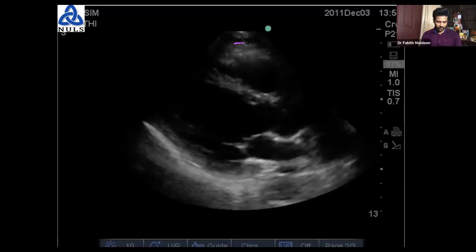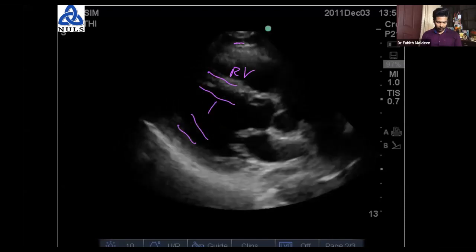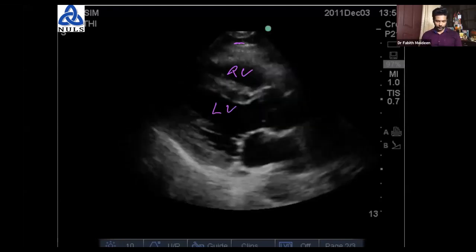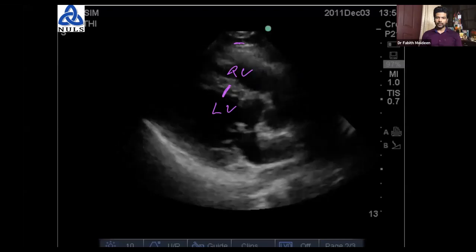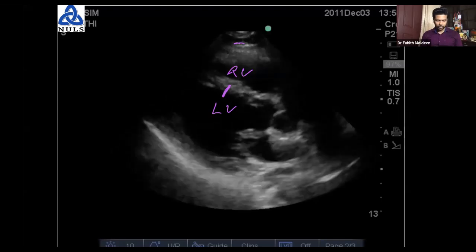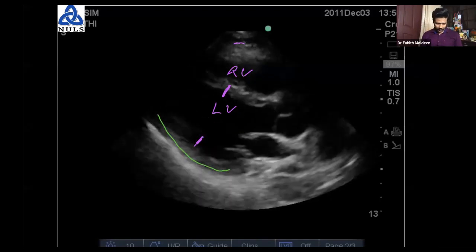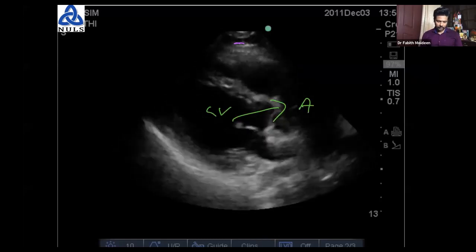Now, if this is RV, okay, you have a tissue here. Okay, you have blood here, you have a tissue here, and there is a white structure there. Okay, you should know all this. Now, this is RV, so this should be LV. Sorry, LV. Okay, I hope it's very clear for you. Now, in between the RV and LV, we have the interventricular septum. Okay, so that myocardium, the grayish thing what you're seeing is the myocardium. That's the interventricular septum. Okay. Now, if this is LV, posterior to that tissue is the posterior wall. Okay, and then you have a white structure there. That's the pericardium. All right. So I think this is clear for you. Now, if this is LV, the blood goes out to the aorta. So there will be something here. That's the aortic valve, and that's the aorta.